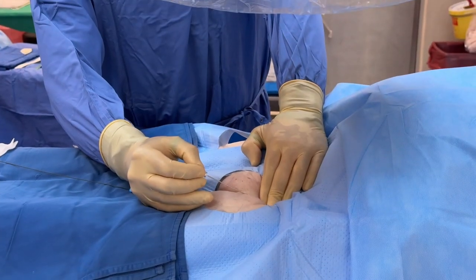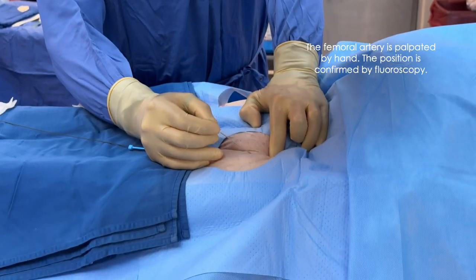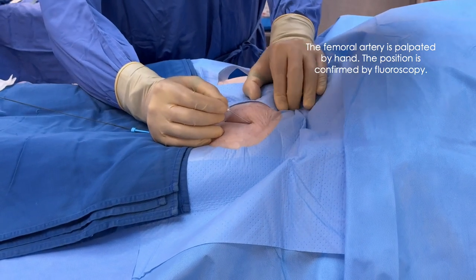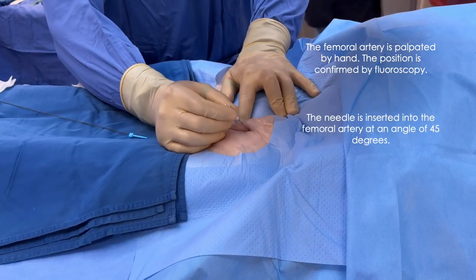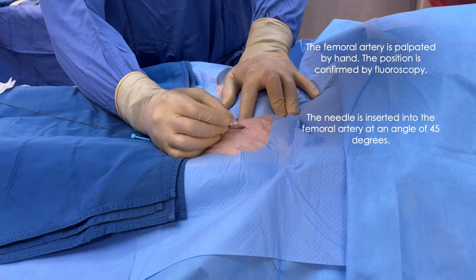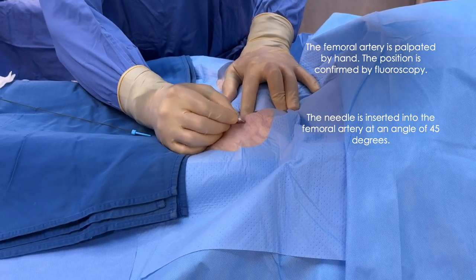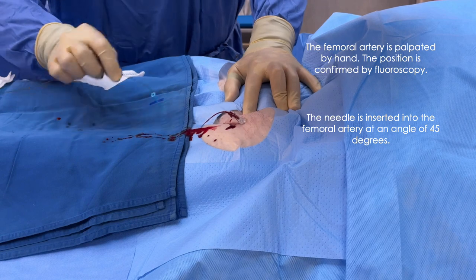The femoral artery is palpated by hand and the position is confirmed by fluoroscopy. The needle is inserted into the femoral artery at an angle of 45 degrees. Correct placement is confirmed by pulsatile blood flow.